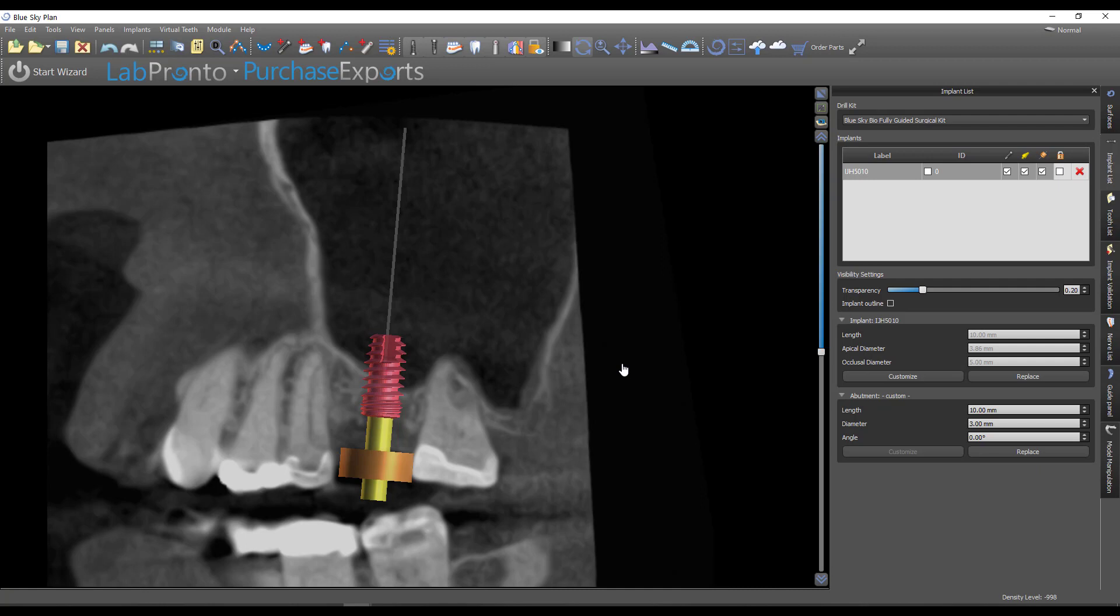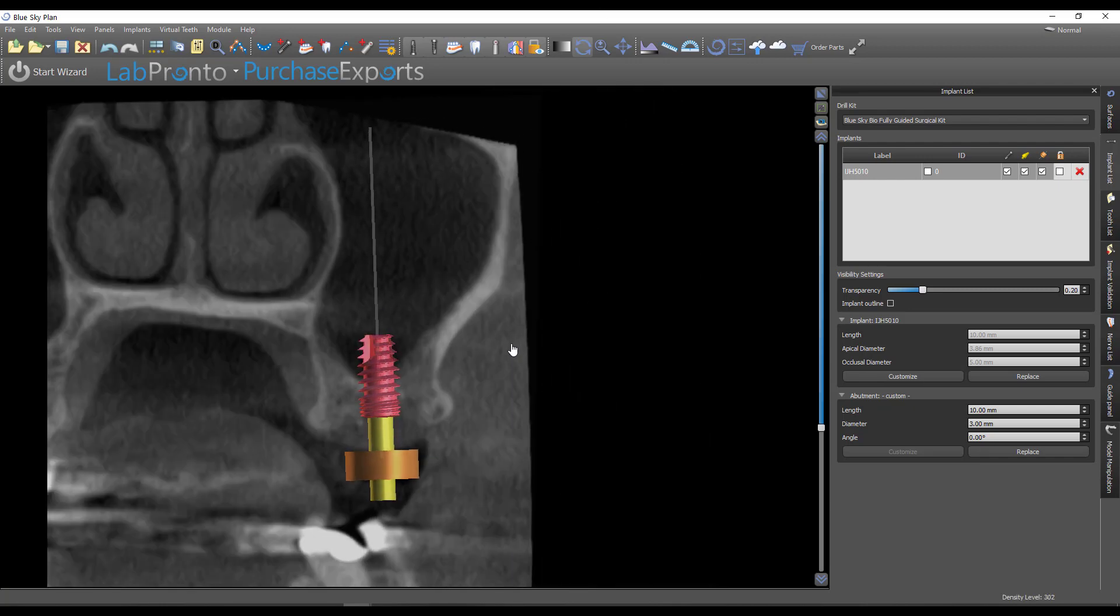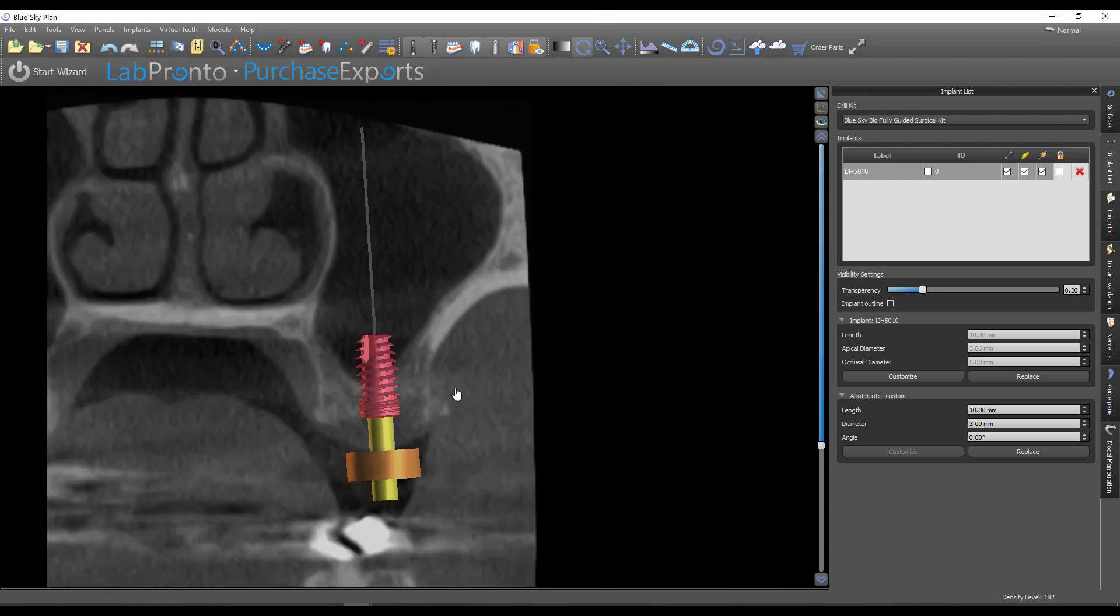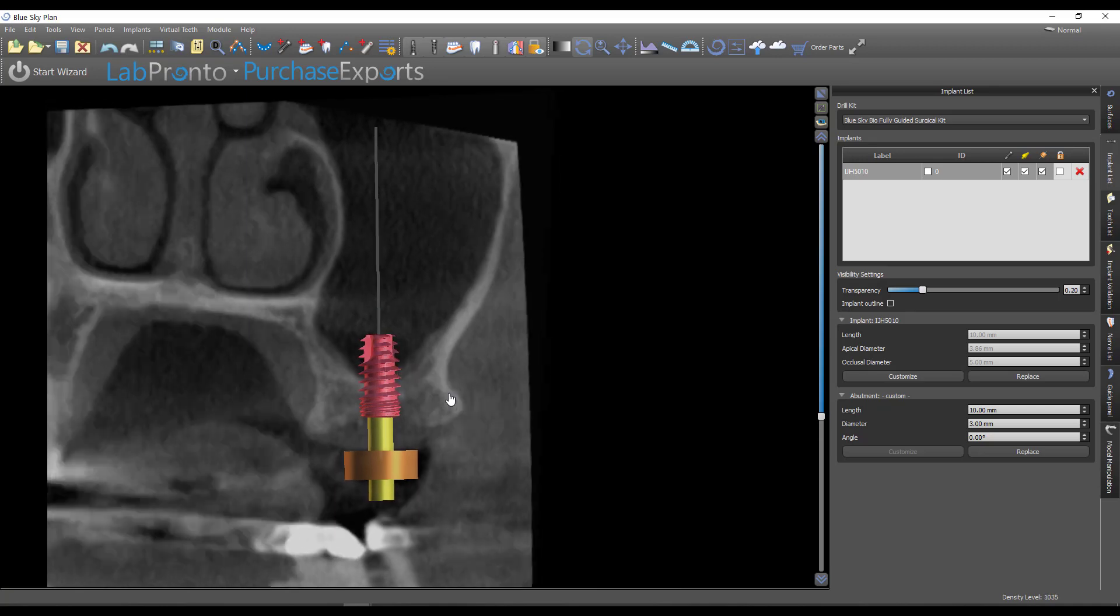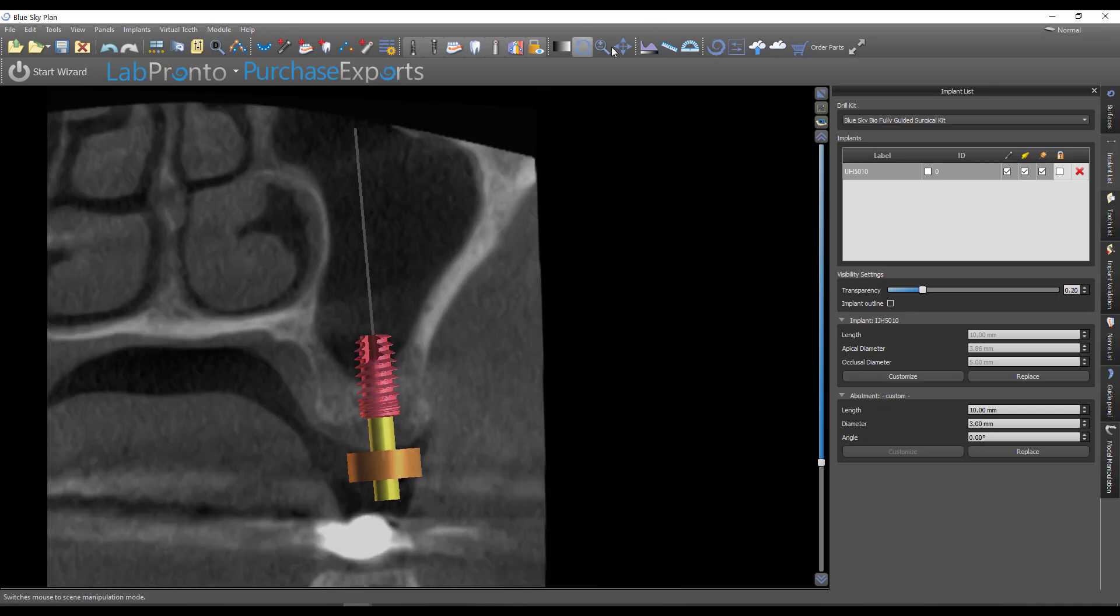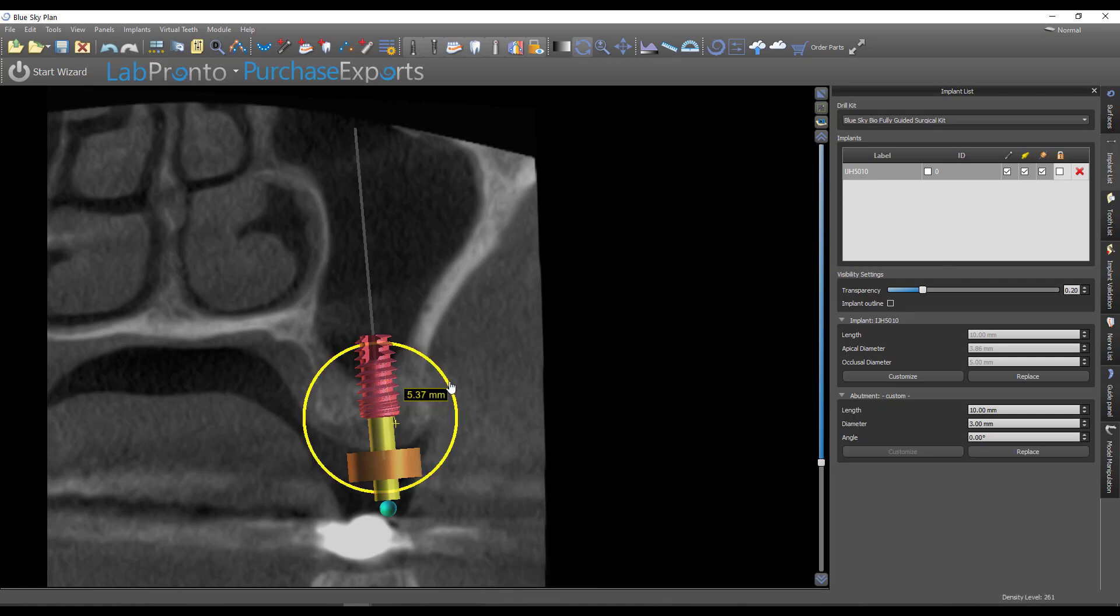Now that's a significant amount of money to leave on the table, and this is just not that difficult of a procedure, and now having that guided makes it even that much easier. So again, you can see the positioning, and if we were to measure the height of bone from crest to the sinus floor, it's about 5 millimeters or so. So he's got a 10 millimeter implant here, so that's 5 millimeters of lift.